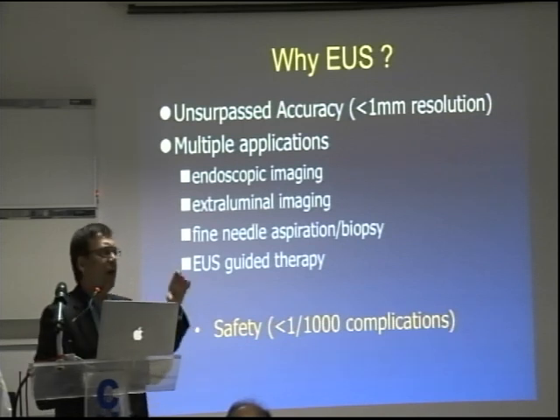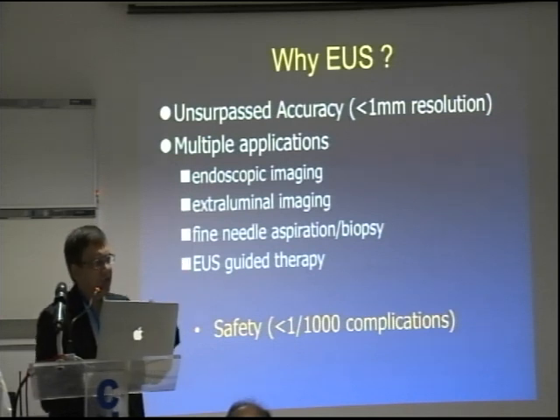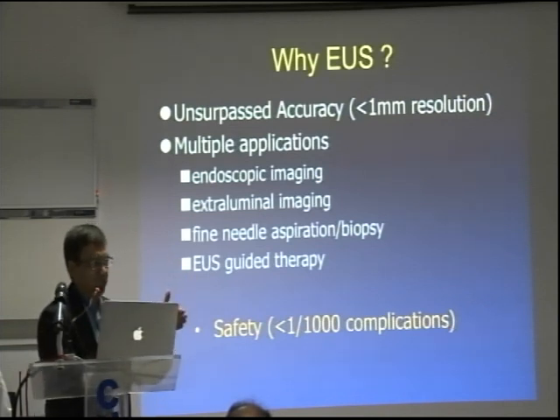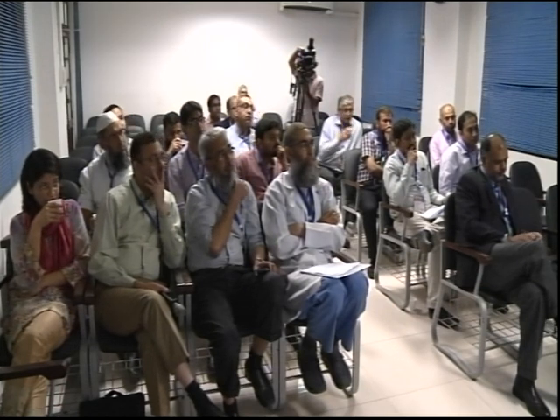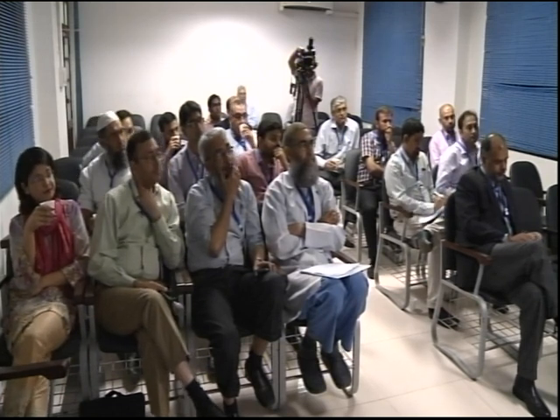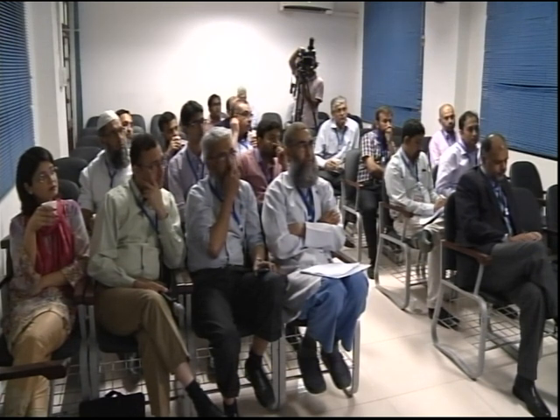Mustafa explained all that gain and everything, but keep in mind the best penetration of EUS waves is up to 4 centimeters, and it completely fades away after about 6 centimeters. So the image you are getting is up to 6 centimeters, but the best one is up to 4 centimeters. So just keep that in mind. It's not like you're going to be able to see the other part of the body through that. Okay.